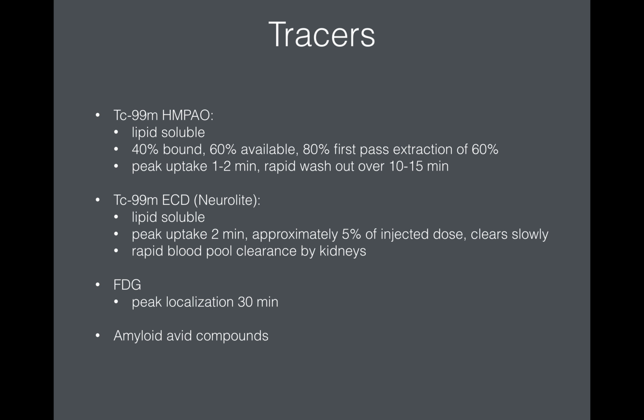FDG, again, we're really well familiar with it, and the brain really likes sugar, so it will take up a lot of FDG, and the peak localization will occur at 30 minutes. There's also a variety of other agents, particularly amyloid-avid compounds that are now used for imaging of Alzheimer's.